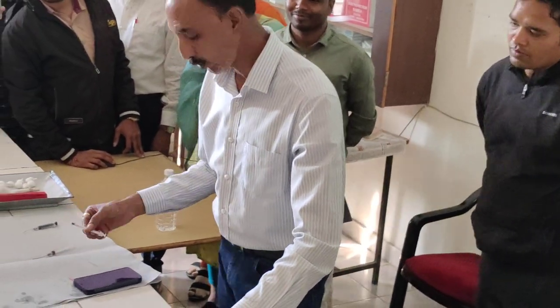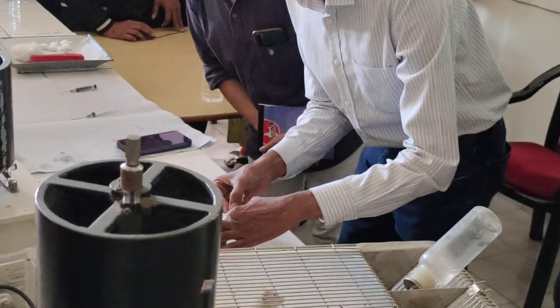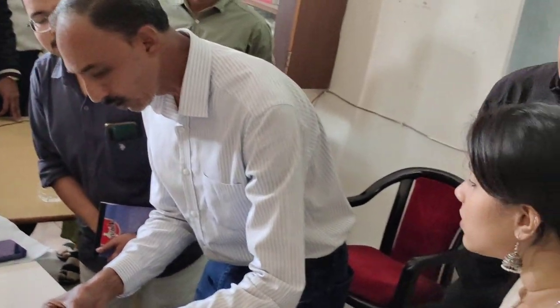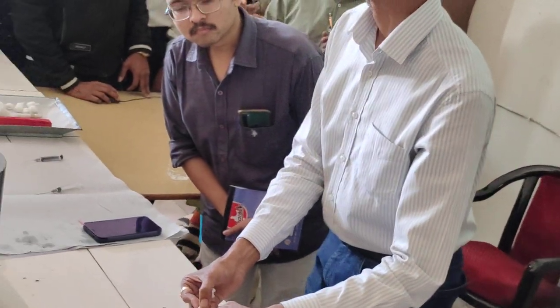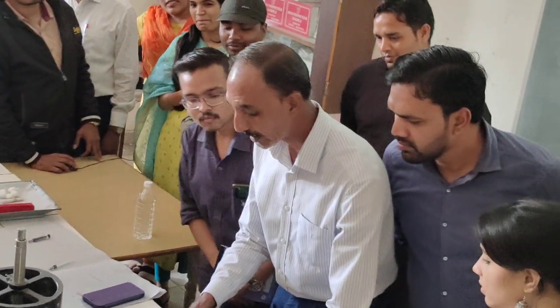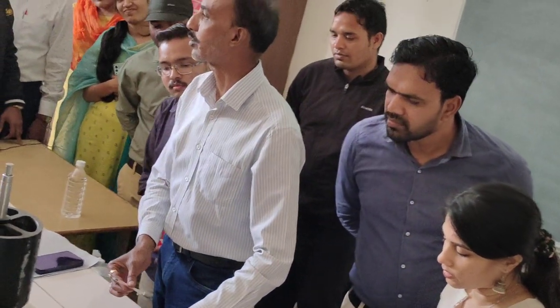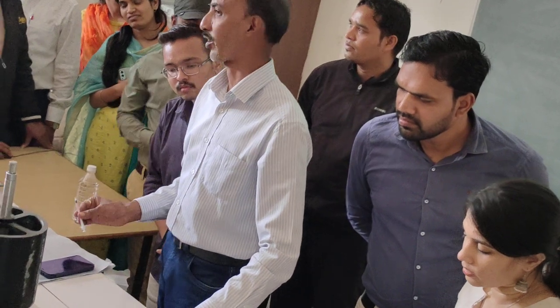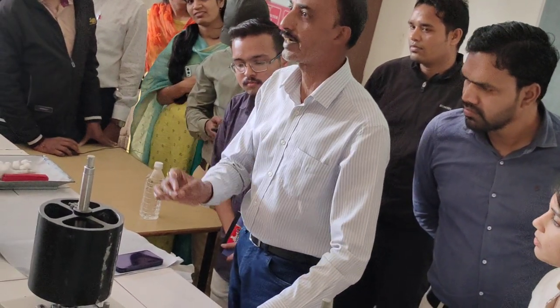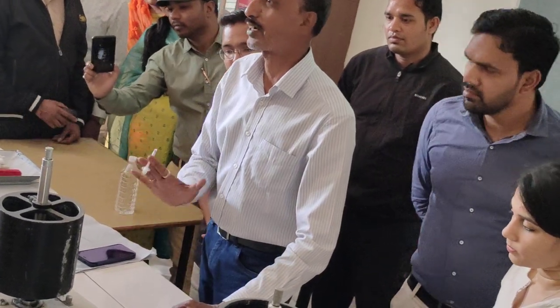Again, we have to find out the vein and we have to prick the needle here and we have to collect the blood. This is the method by which the blood is collected from the tail. Without a restrainer it is very difficult to hold the animal and collect the blood, because pricking the needle into the veins requires the animal to be calm and quiet.